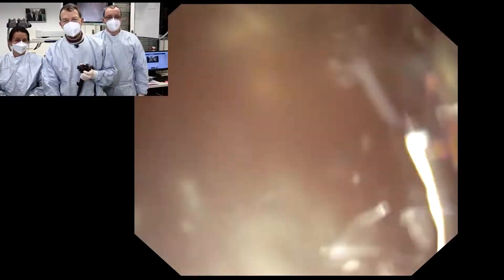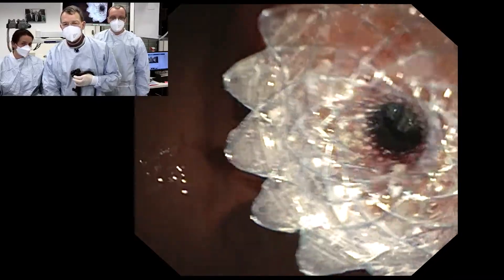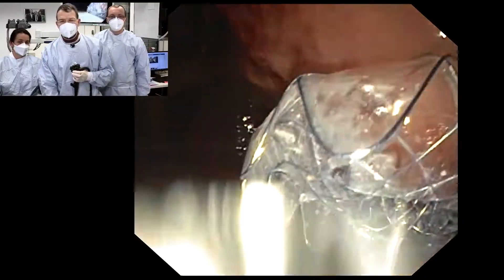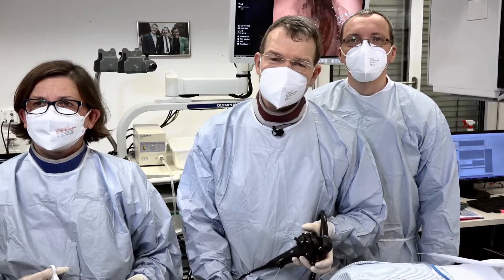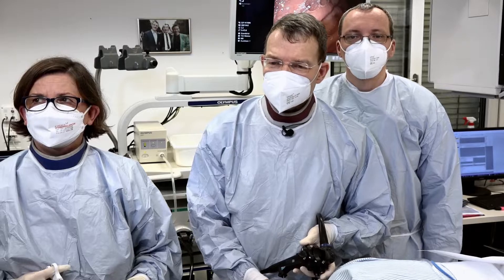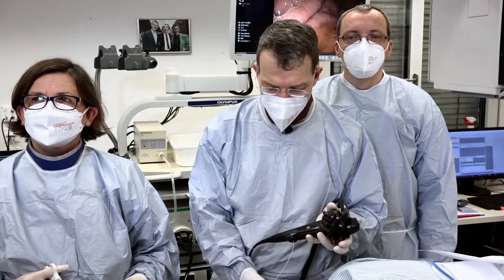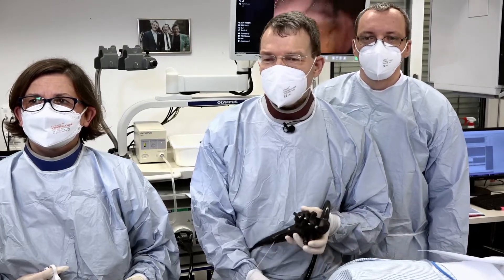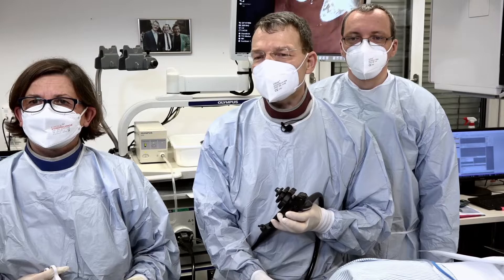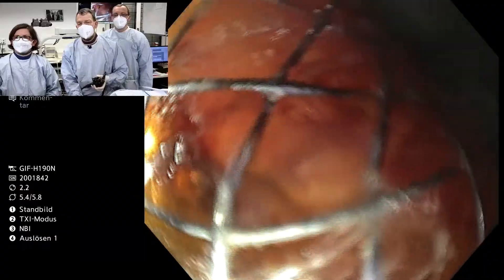Here you can see the stent. At the moment we don't have great vision because there's a lot of fluid, but here you can see nicely into the cavity. The stent is successfully deployed. After deployment of this Hotspaxos system, we would like to go into the pseudocyst cavity, for which I'm using a pediatric endoscope — the Olympus H190N — and I'm carefully forwarding the endoscope to the stent. We are now in front of the stent.